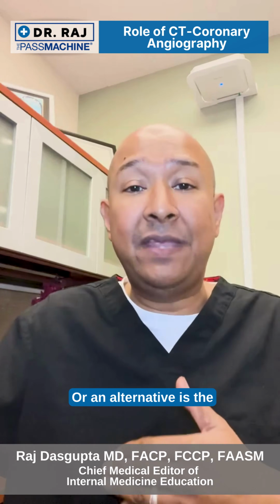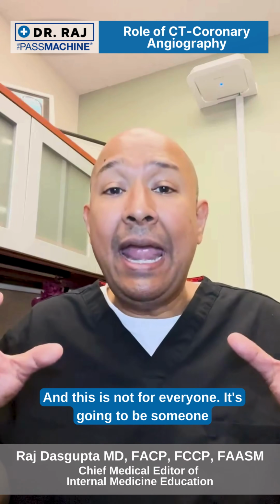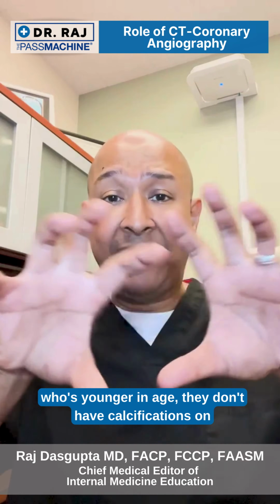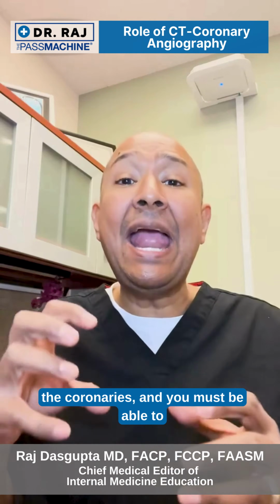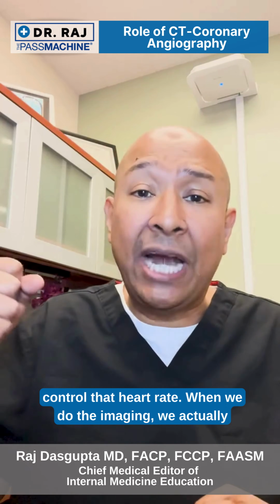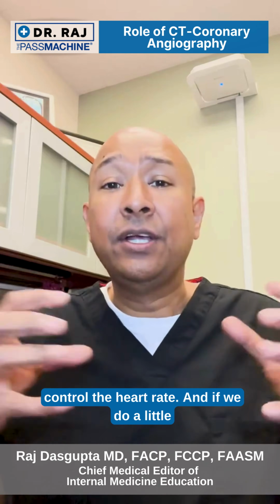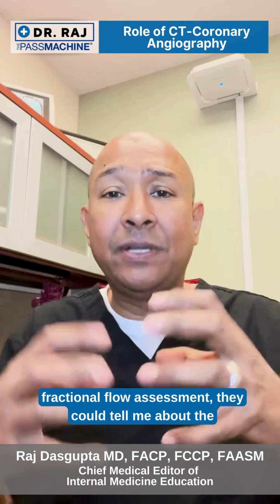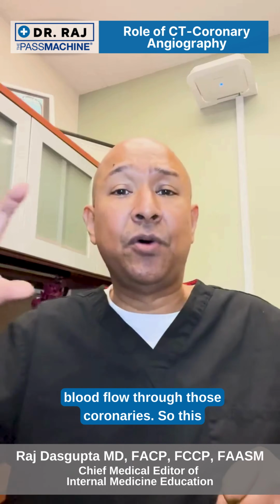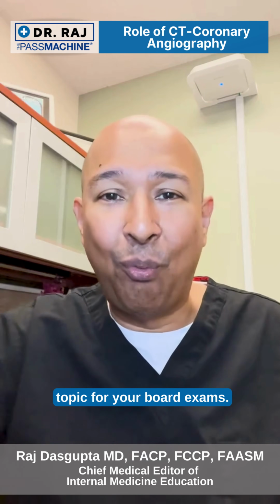Or an alternative is the CT coronary angiography. And this is not for everyone. It's going to be someone who's younger in age, they don't have calcifications on the coronaries, and you must be able to control that heart rate. When we do the imaging, we can actually give a medication like a beta blocker to help control the heart rate. And if we do a little fractional flow assessment, they could tell me about the blood flow to those coronaries. So this diagnostic imaging is a high-yield topic for your board exams.